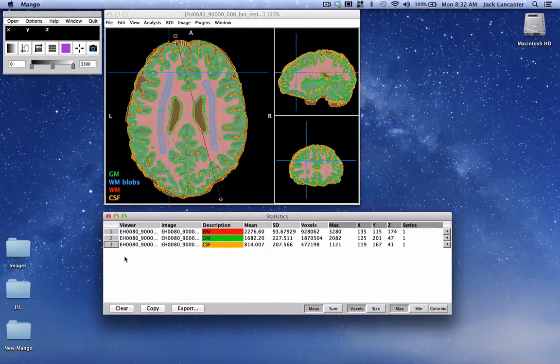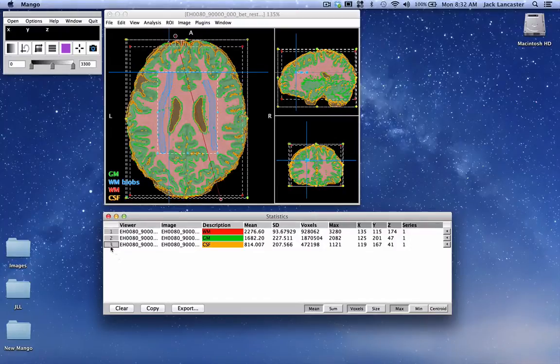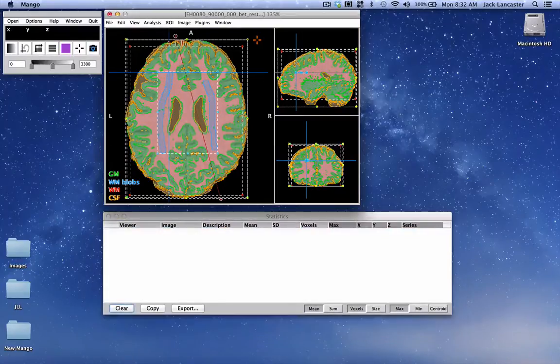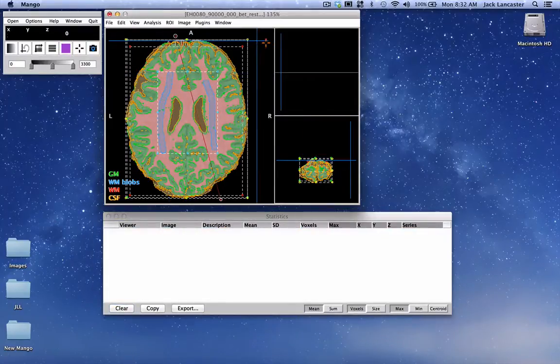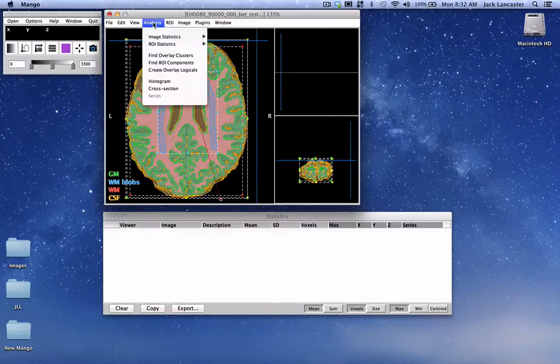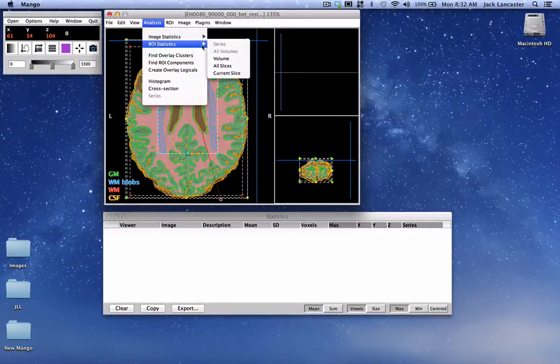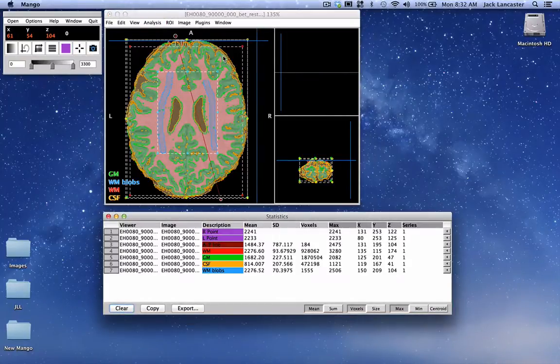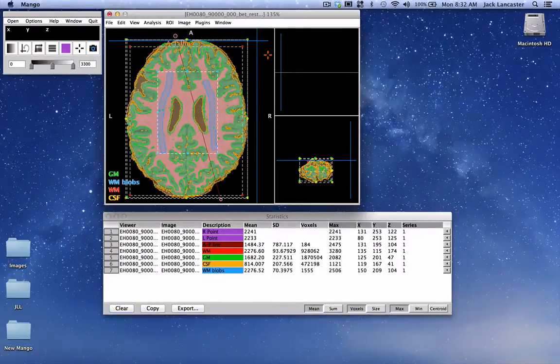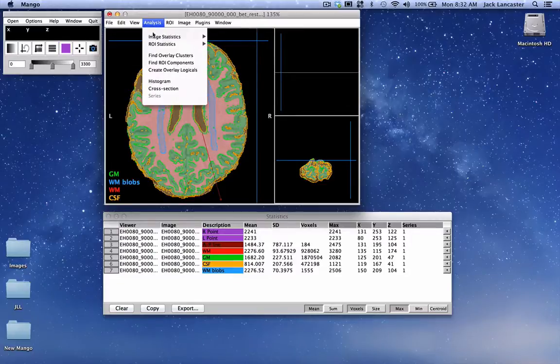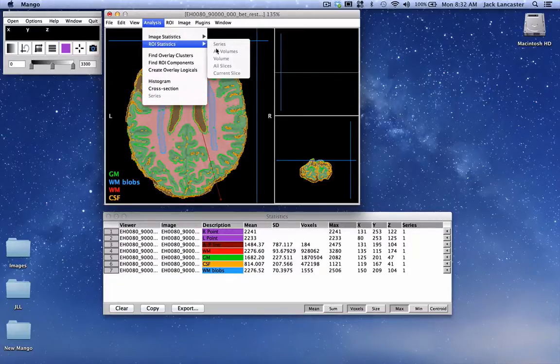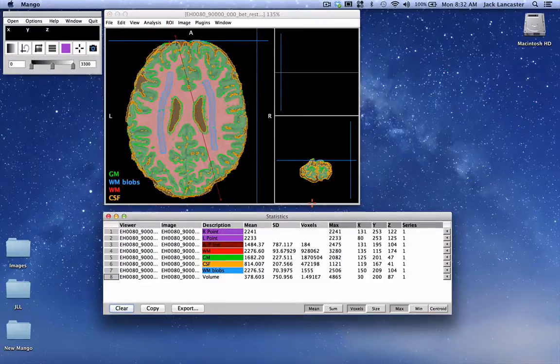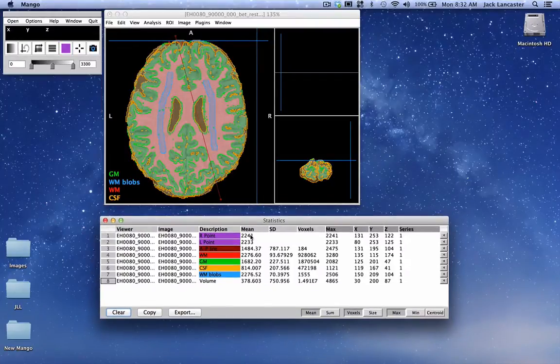We can come down here and select everything and then clear it. We've selected everything up here and this is the traditional way for getting analysis of many regions: select everything and then go to statistics for regions and then we see all the region analysis there. We can deselect things by clicking outside. We'll do the image statistics as well so we have a complete listing of what we can do statistics here.